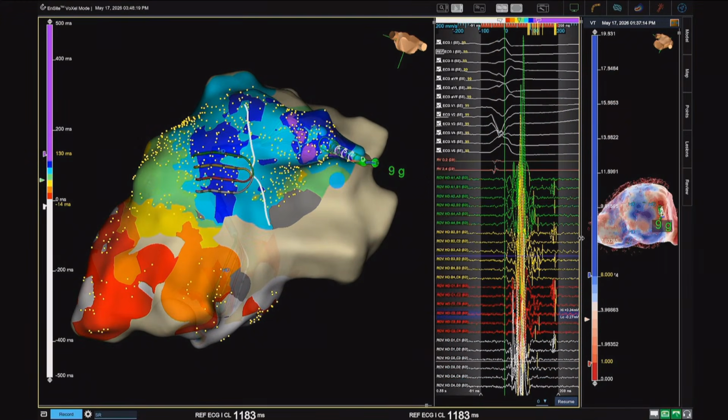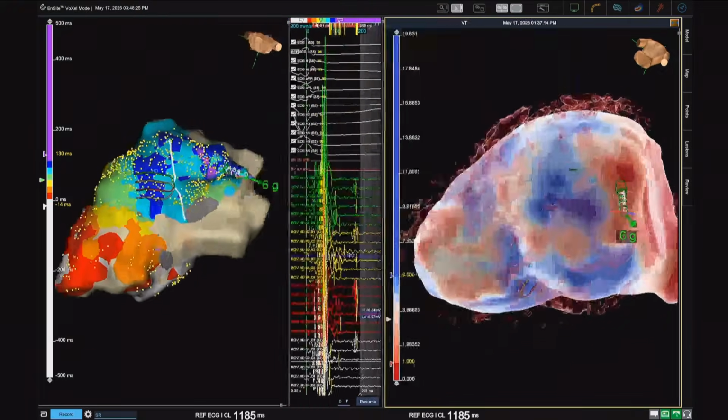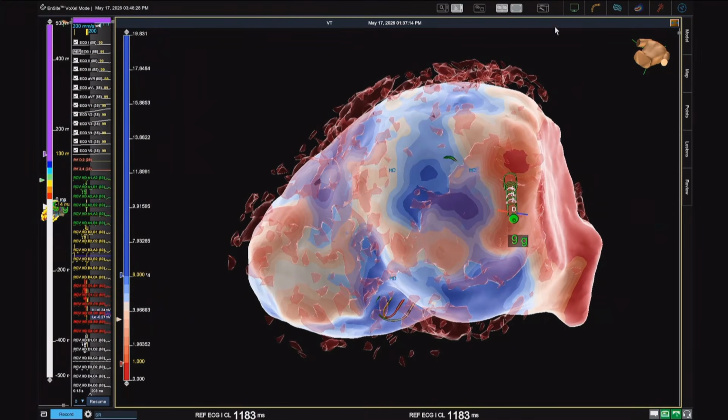Yeah. Can we switch to Insight for the audience? Show the CT without fat, Maria, please. Can you enlarge the CT? Don't show the map yet, please. Switch off the fat, please, or hide the fat.